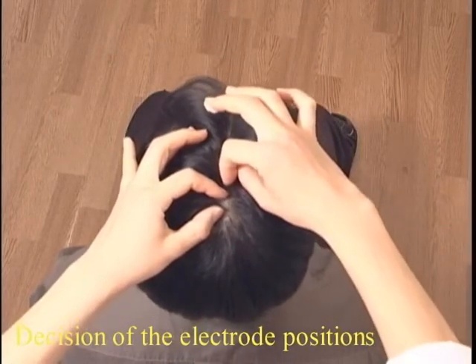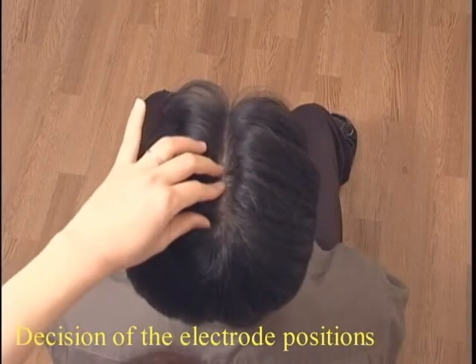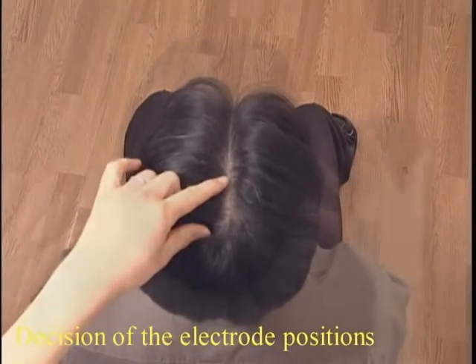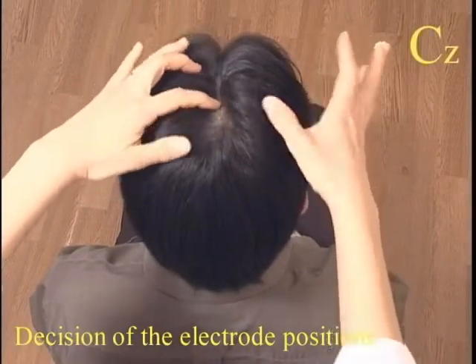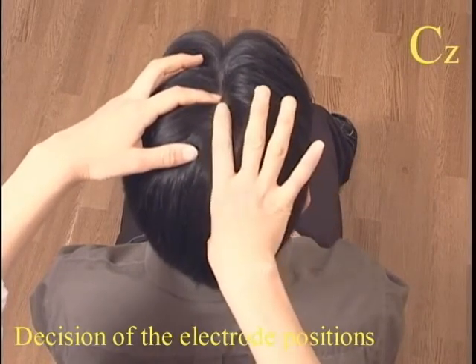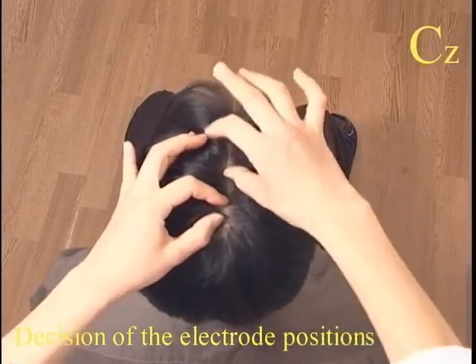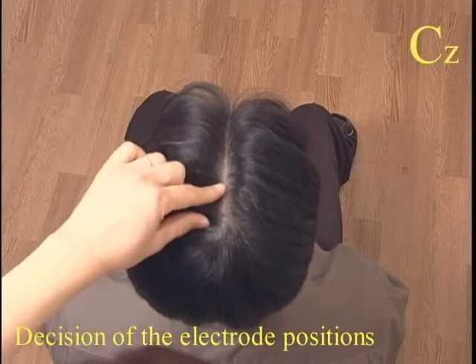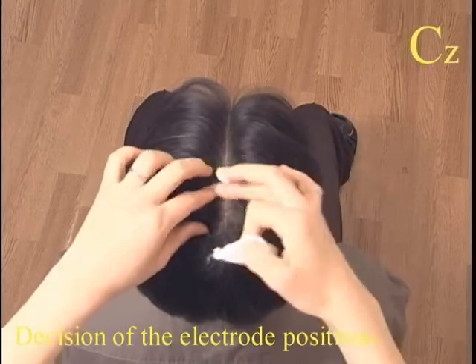The first electrode to decide is CZ. Since this electrode serves as the reference point for the left, right, front, and rear positions, this is the most important step. Use 2 hands to decide the midpoint of a line joining the 2 tragus. Mark this point by continuing to press with a finger. Decide the line that passes through this spot and joining the nasion and the inion. The midpoint of this line is the CZ position. During measurement, use the same hand and the same finger and take care to avoid errors due to the shape of the hand.